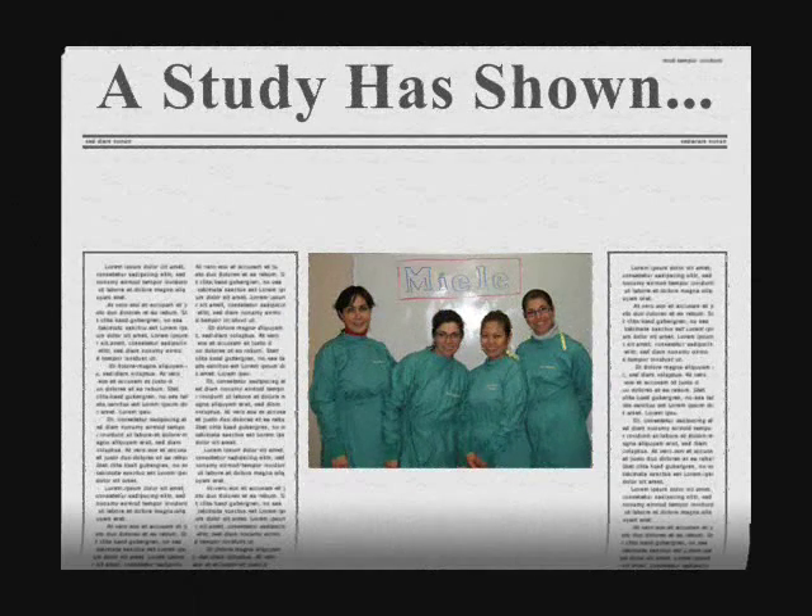Studies have shown that the Millay thermal disinfector can destroy bacterial contamination by more than 99.99%. The Millay disinfector eliminates the need for pre-soaking, rinsing, and hand scrubbing. By reducing the staff workload, it allows for more chairside time and results in increased revenue.